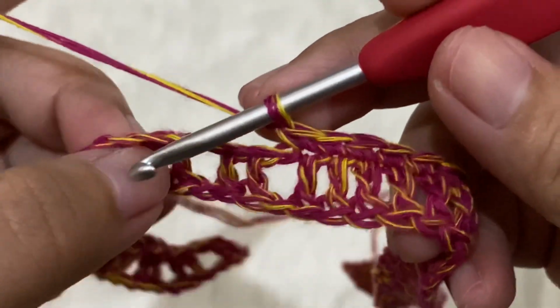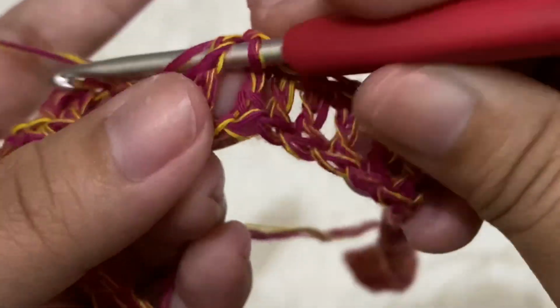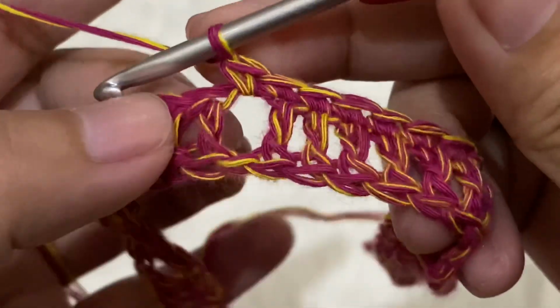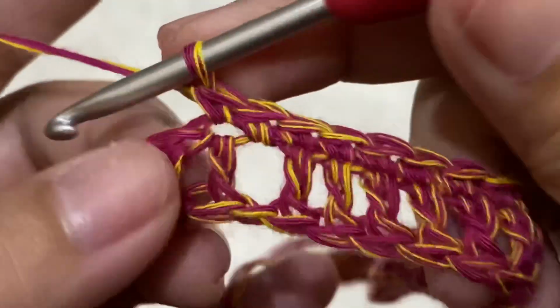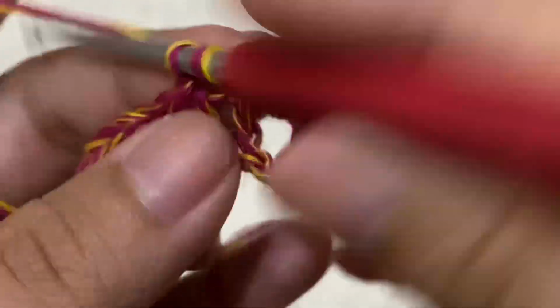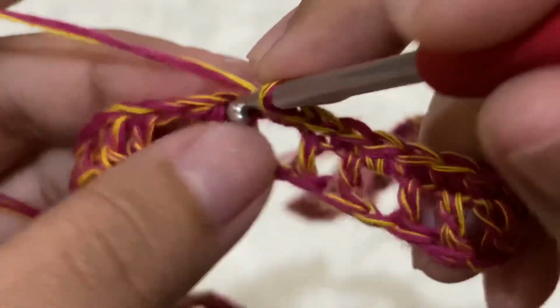Okay, so when you reach this part where we have the buttonholes, just single crochet around the chain space. Again, I just continue this pattern, single crochet on the double crochets and then around the chain space. Okay, so just keep doing so until the end.